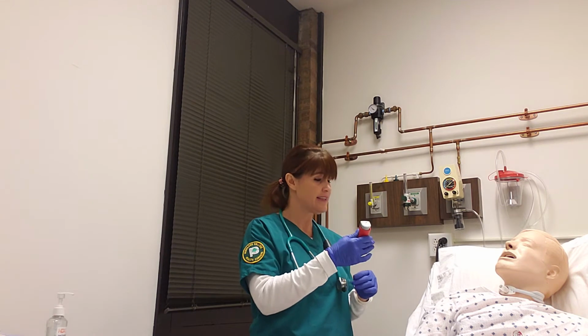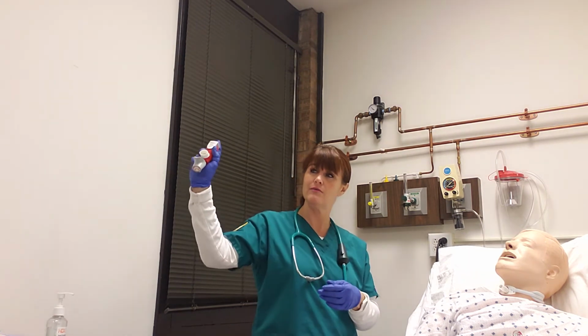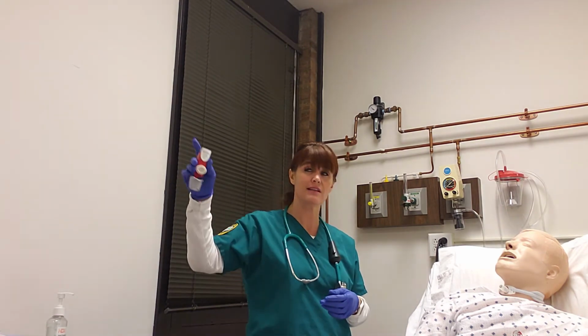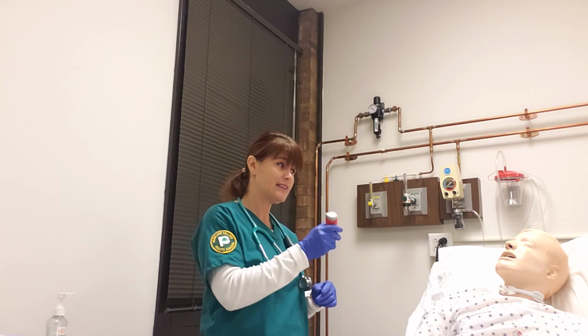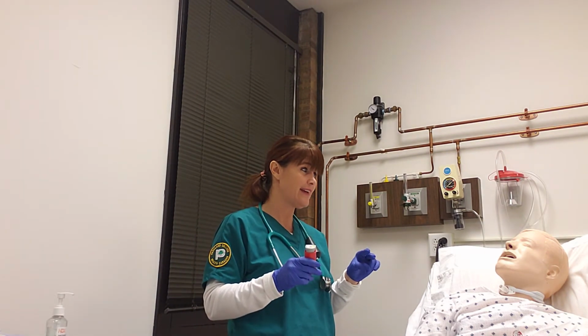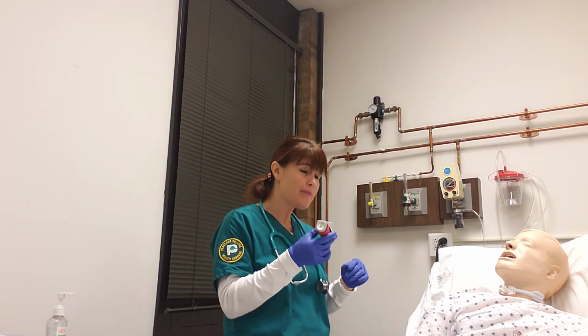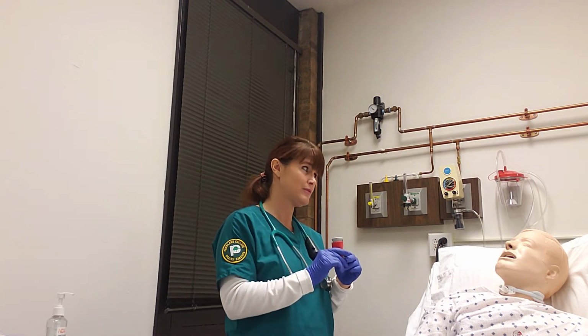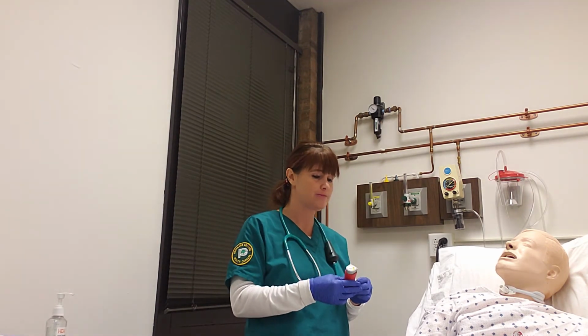We need to prime these. Okay, so how you prime these is you shake them, take the lid down, spray once. Shake again, spray again. You may need to do this if you let it sit 7 days, but don't do that, because I want you to take this twice a day, 2 puffs twice a day, morning and night. But if something happens and it's sat over 7 days, you must prime it. Or if you happen to drop it on the floor real hard, then you need to reprime it.